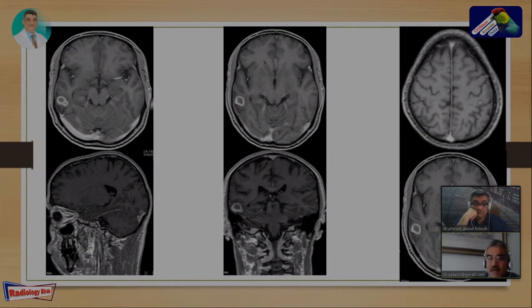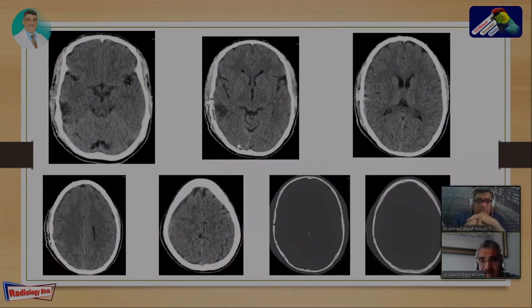Of course, it can be tumor, it can be metastasis, ring enhancing lesion. Of course, you know that abscess and granuloma can too, but we found that there is no space occupying mass effect. It's not an active abscess, and this is even an additional problem.